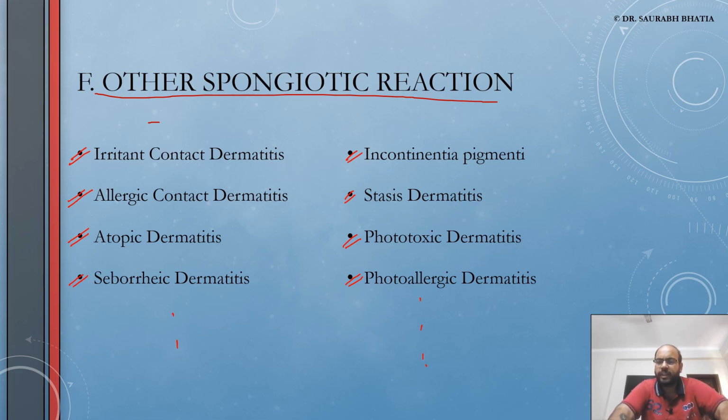You can see a focus of spongiosis. Okay. So these are all foci of spongiosis. And that's what you see in pityriasis rosea. If you miss the parakeratotic mound, if you miss the mild spongiosis, you can easily miss pityriasis rosea, hence invisible dermatosis. So you have to look for it.